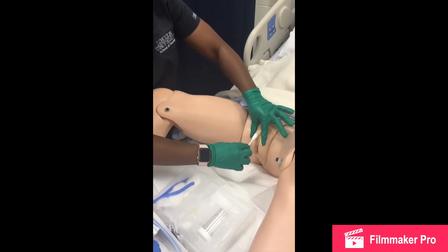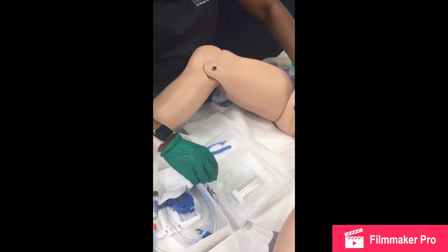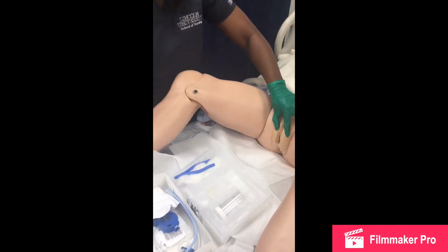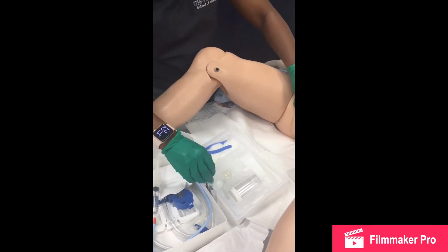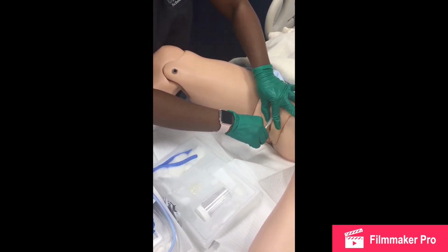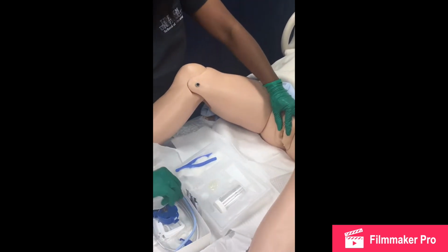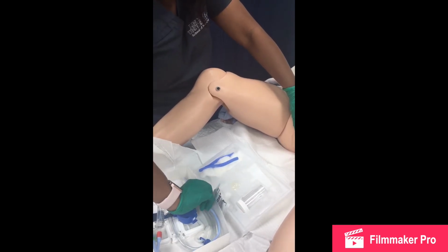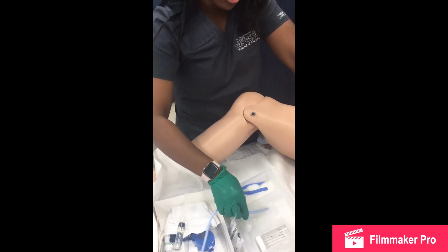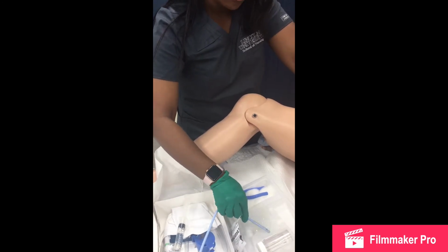I'm going to start with the outside. Toss it. Around the inside. And then I'm going to do one swipe down the middle. Just like that. Next, I cannot move my hand, so I'm going to take my tube and I'm going to lubricate it very well. Like so.